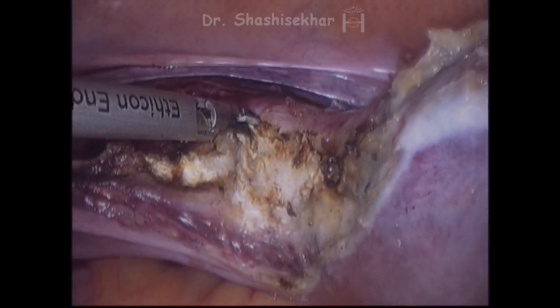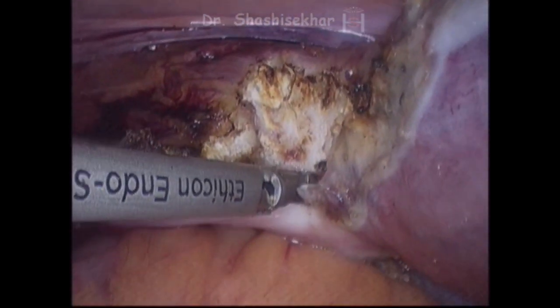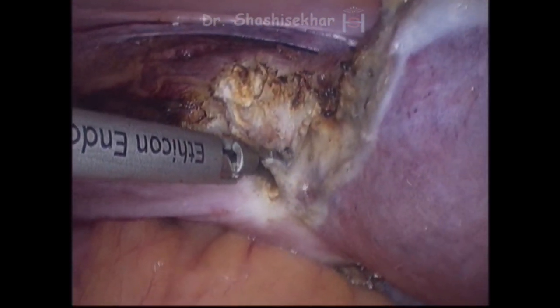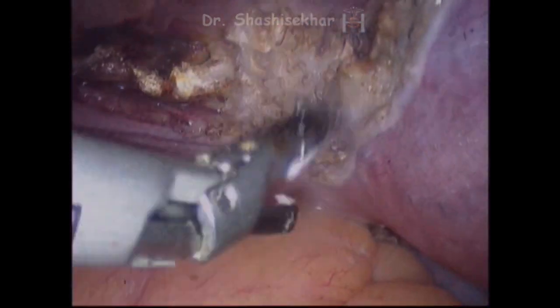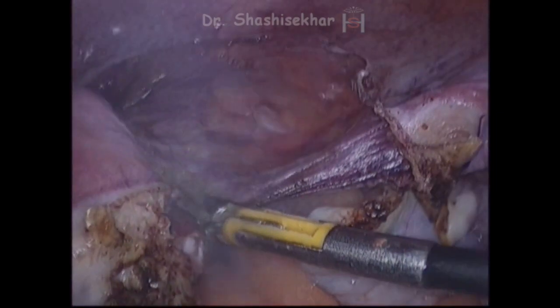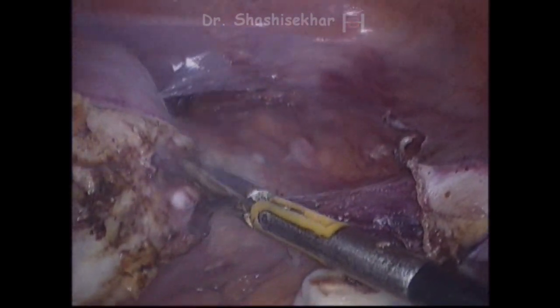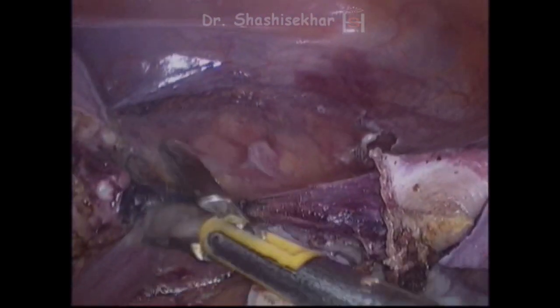Same thing is repeated on the right side as well, using a bipolar to coagulate the area of the uterine artery. You need not worry about the ureter because you have dissected out the anterior and posterior layers of the broad ligament, so the ureter won't be anywhere near this artery now.